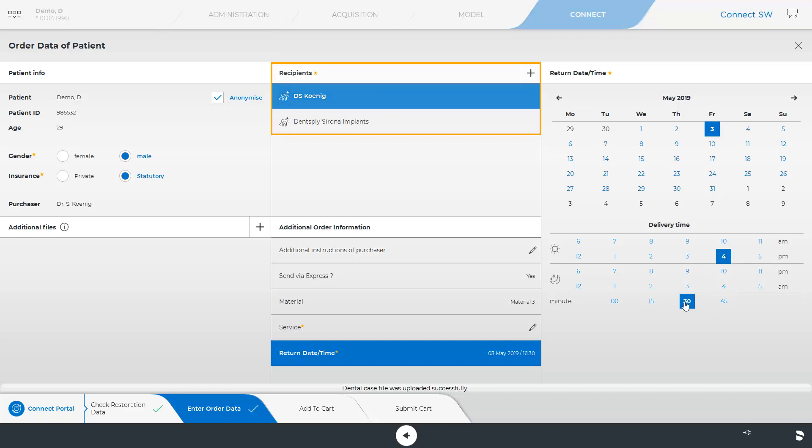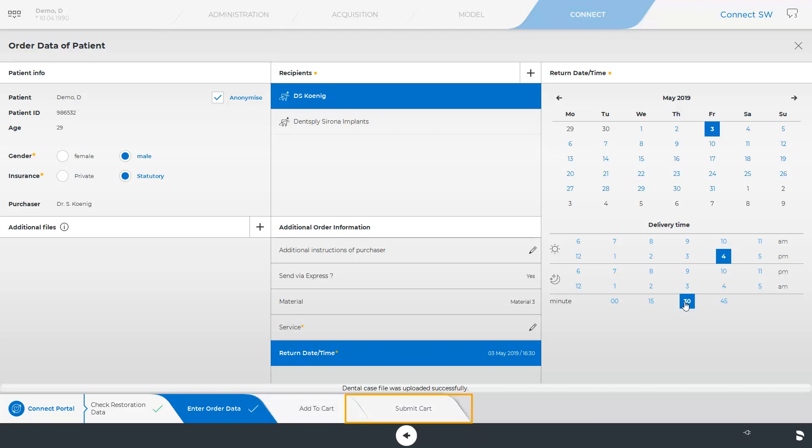Ensure that the correct recipient is selected before sending the data. In our case, we can choose between the dental labs named DS Koenig and Dentsply Sirona Implants. In order to use intraoral scan data for ordering Atlantis or MySimplant products, the option Dentsply Sirona Implants should be selected. After determining all obligatory fields, we can either add the order to the cart and collect further cases for transmission, or submit the cart directly.